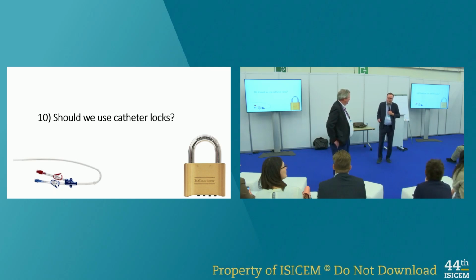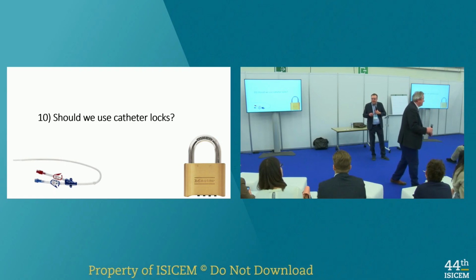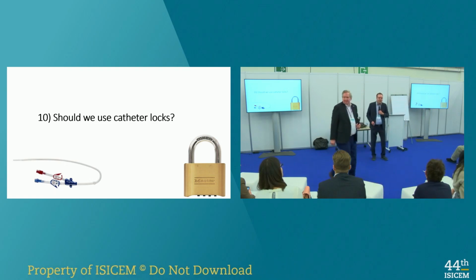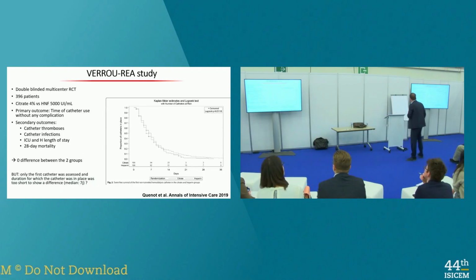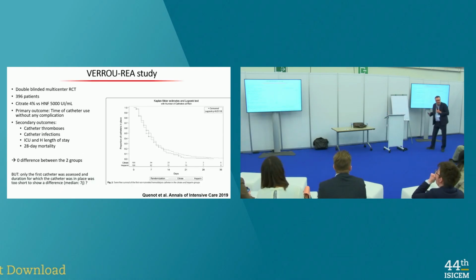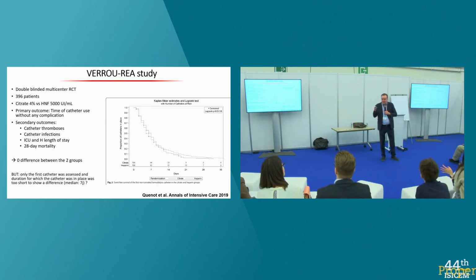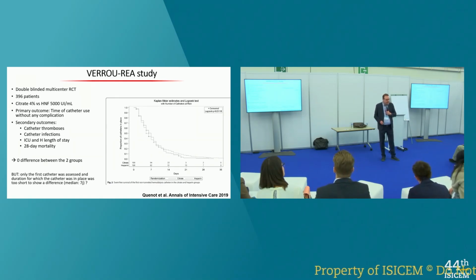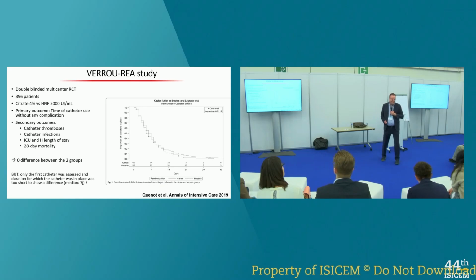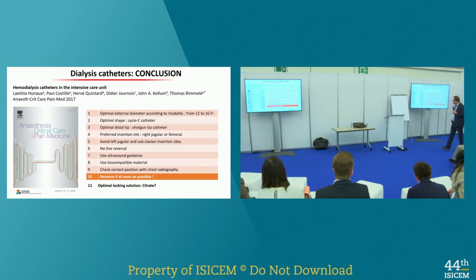I think now it's good to put a locking solution to avoid any thrombosis while the patient is in the operating room. So the answer is yes, and it's actually demonstrated that the locking solution is better with citrate as compared to saline. The locking solution should not be saline. Citrate locks and heparin locks are better than saline solution, demonstrated in this study.